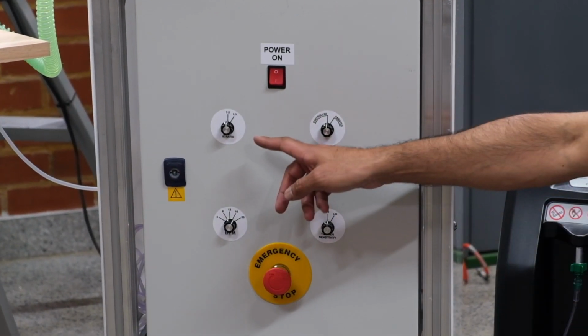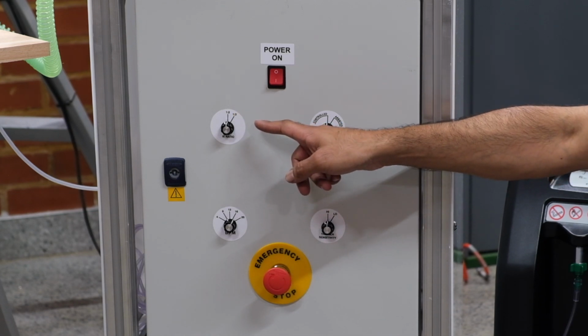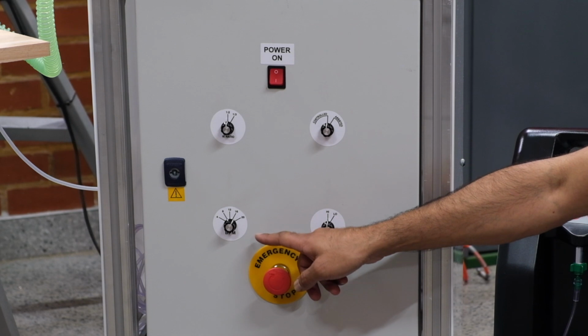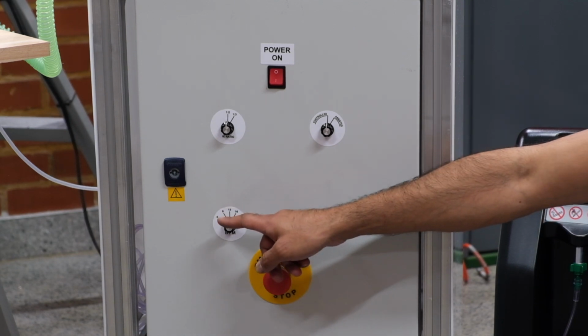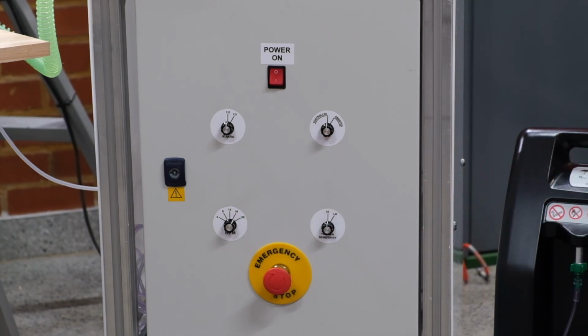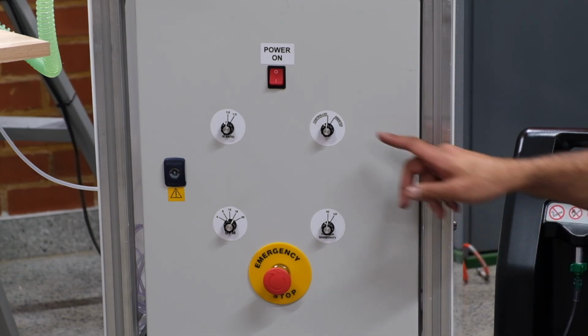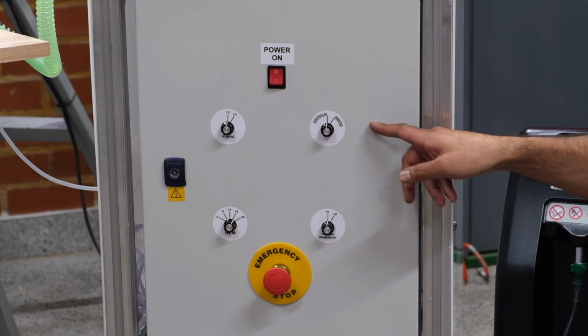The inspiratory-expiratory ratio is now set to either 1:2 or 1:3. On the breaths per minute, I've added 2 further breaths per minute, so that's now 4, 8, 12, 16 and 20. That's so that the patient can take unassisted breaths in between assisted breaths. You can now set the ventilator to both a controlled mode and an assisted mode.